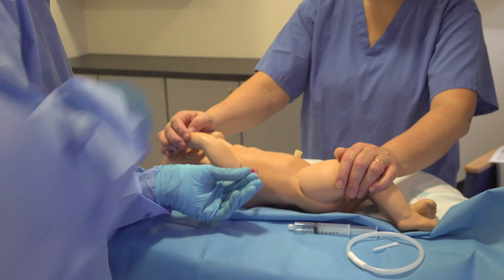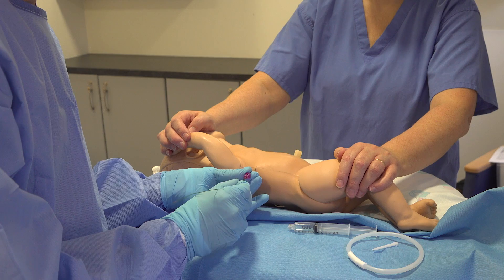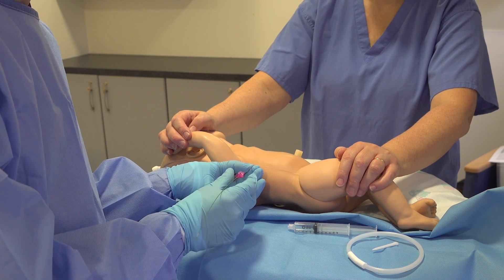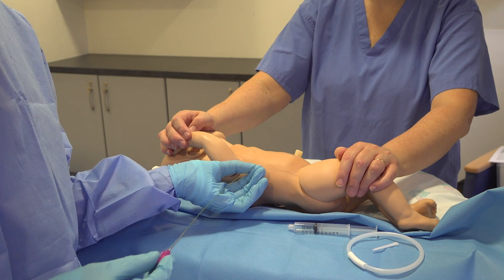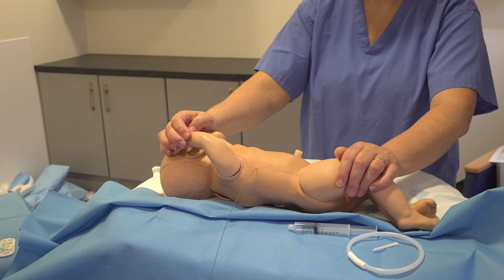Take the white bit off and remove your needle, holding on to the guide wire as you go so that it doesn't displace. That is the sharp end, so make sure you keep yourself safe and get rid of that.